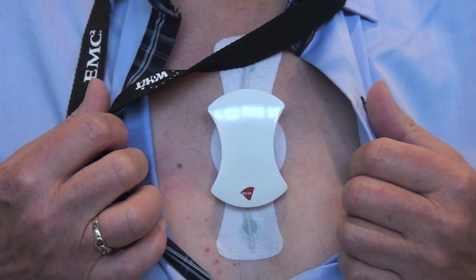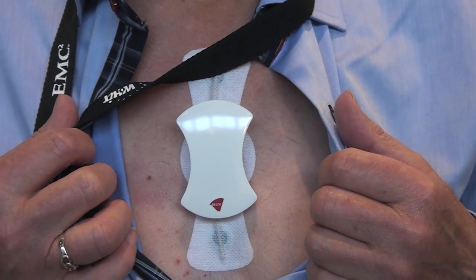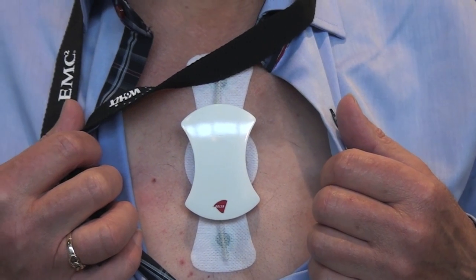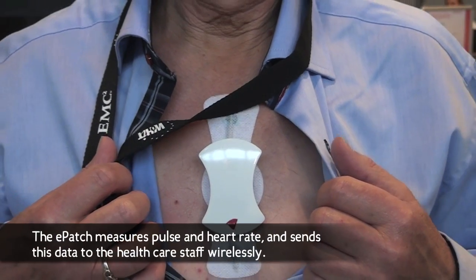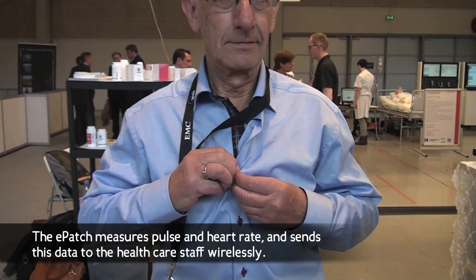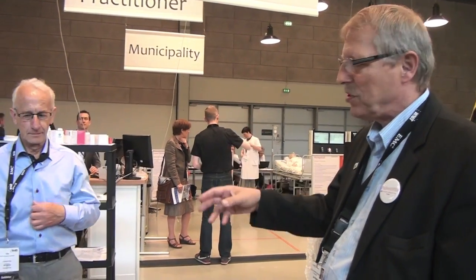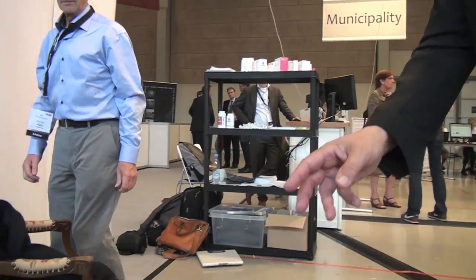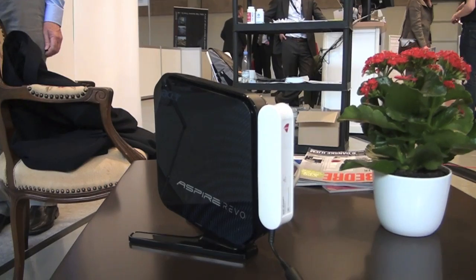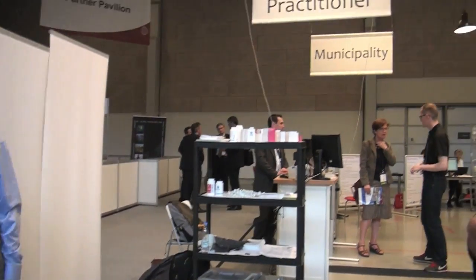This e-patch is recording the heart activity, the ECG, from the patient on a 24-hour basis. So in this case, the patient is going to wear this e-patch for 24 hours. That doesn't mean he's confined to his home. He's actually free to move around as he pleases. Every time he comes home, the patch will send wirelessly recorded information to this box that will then transmit it to a central server, so it's ready to be evaluated by the healthcare staff.